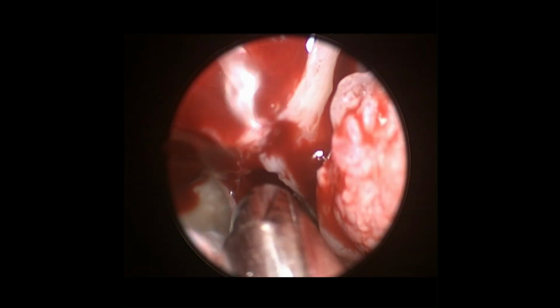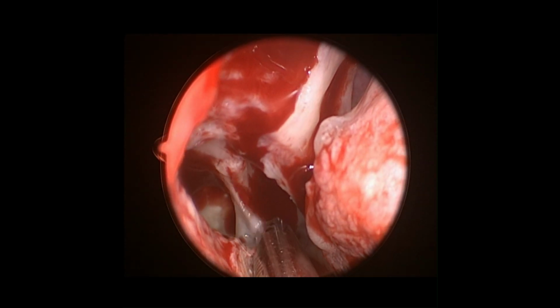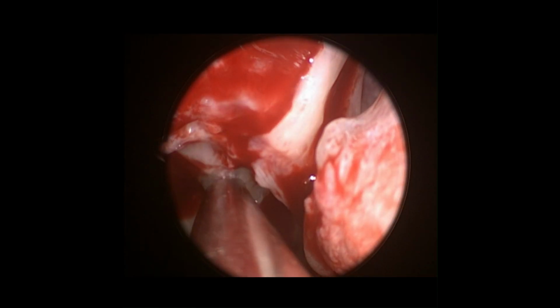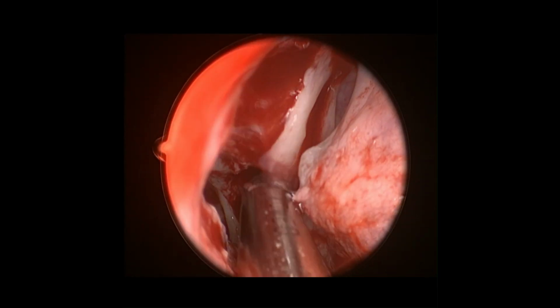Fourth step is removal of the bulla ethmoidalis by breaking the posterior cell wall by passing the J-curette in the retrobullar space.